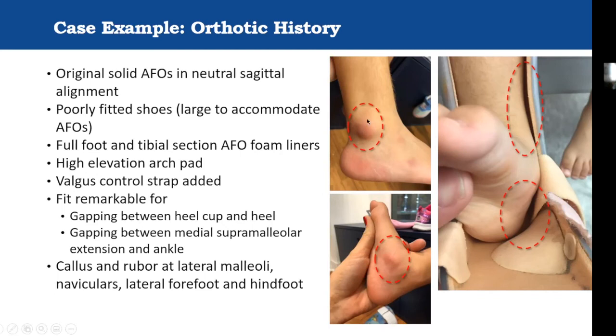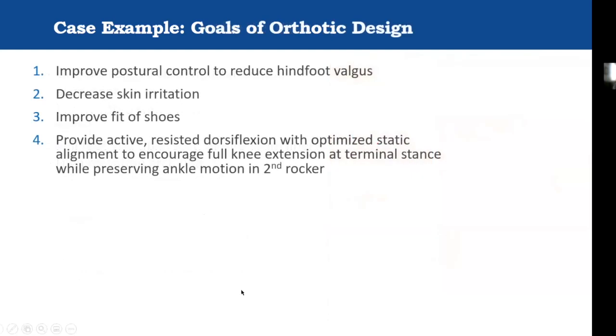She had a lot of callousing there. Distal lateral calcaneus also had some irritation, and I think that also was due to her basically pronating, her valgus in her hindfoot being uncontrolled. And so all of that was occurring in the orthosis and somewhat challenging for this orthosis to manage.